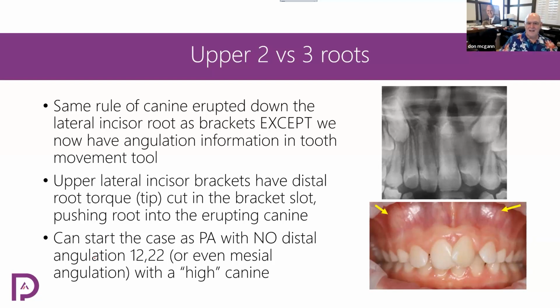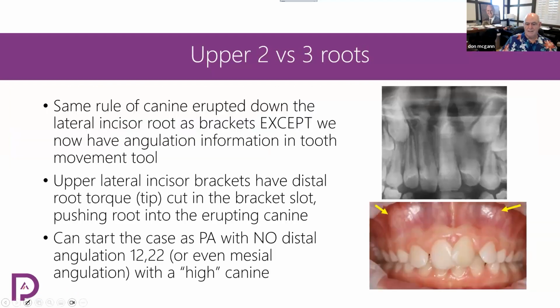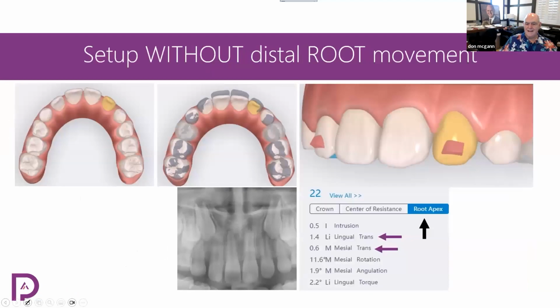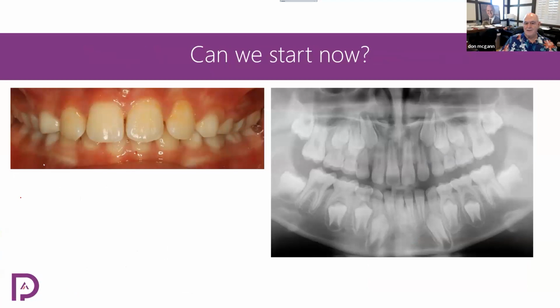So lateral incisor brackets, we do not want to do this, okay? But we can start an aligner with this, and I'll show you how. Let's see. Not yet. That one. Okay, next 2 slides now, I'll show you how. Okay, so how about this one? We have some spaces. We got the lateral too close to the canine. We do not want to push those laterals laterally into the canine eruption.